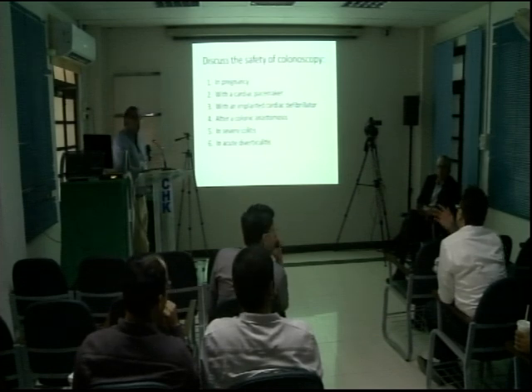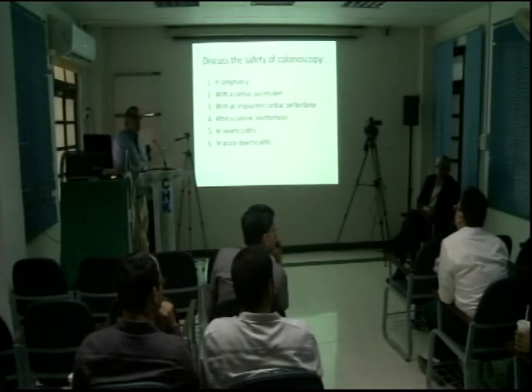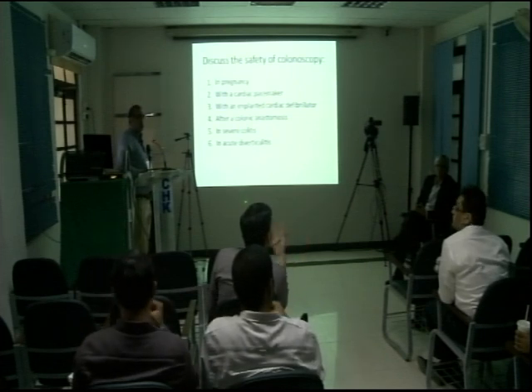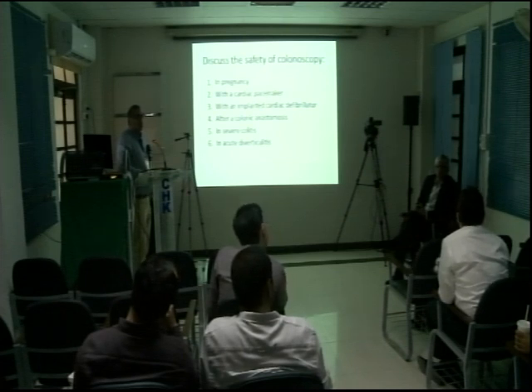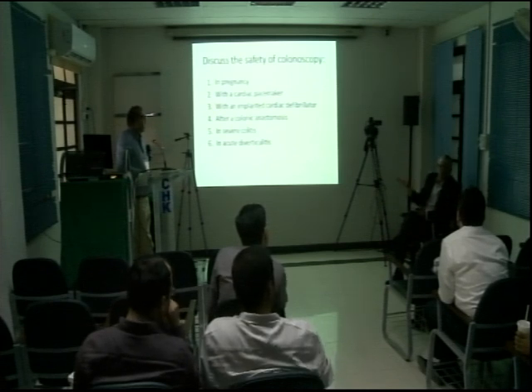Is there any guideline, sir, especially for surgical patients who have already undergone any type of anastomosis? To define the anatomy, should a barium study be done before, or any marker? Nobody does that anymore. What kind of surgical anastomosis they have done, what the anatomy inside is, not anymore. I only do it now for very severely constipated young patients, just to look for a very long distal redundant colon, adult Hirschsprung type of thing, because otherwise you wouldn't be able to pick it up. But otherwise, no.